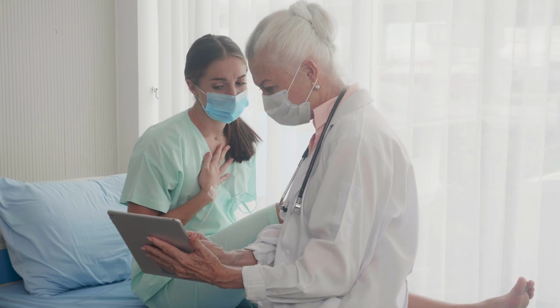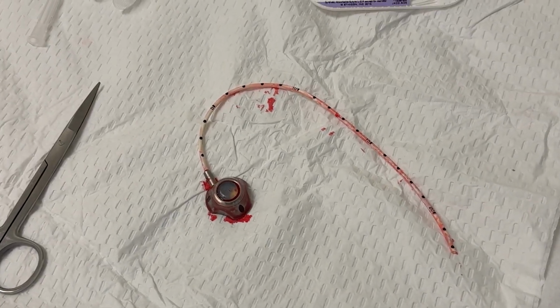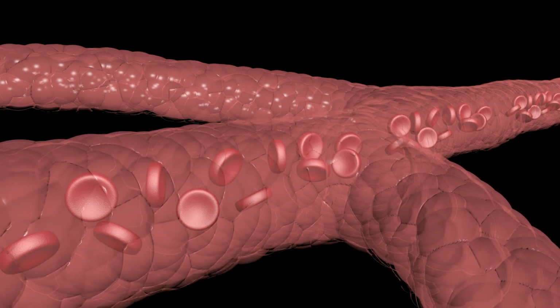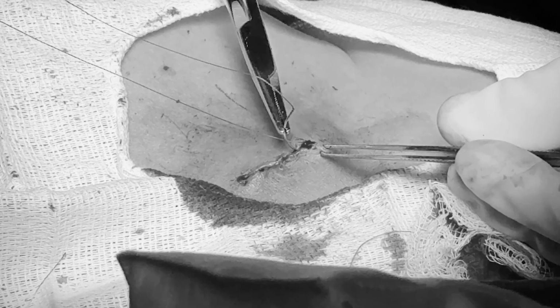Patients are often very worried, like, what about the catheter that was going into the vein? Is it gonna bleed from the hole after you remove the catheter? And the answer is no. Well, for starters, the vein has a low pressure system, so usually any bleeding would stop on its own almost right away. But also we tend to put a little stitch in the area so we'll prevent any bleeding. Yeah, severe bleeding is never a problem with this.